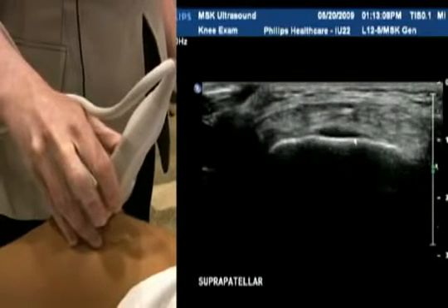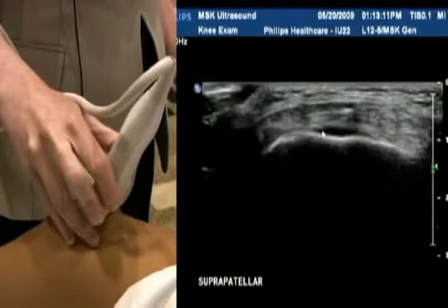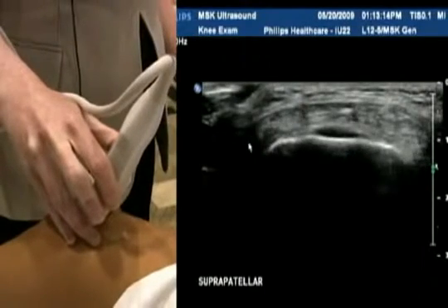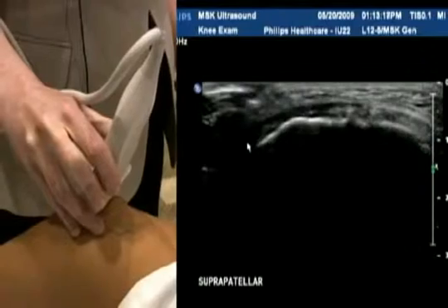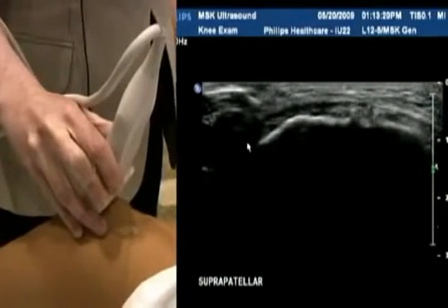Underneath, you'll see a small amount of cartilage — this is quite normal. Try not to mistake this for fluid. Just tracking it all the way down onto that superior portion of the patella.